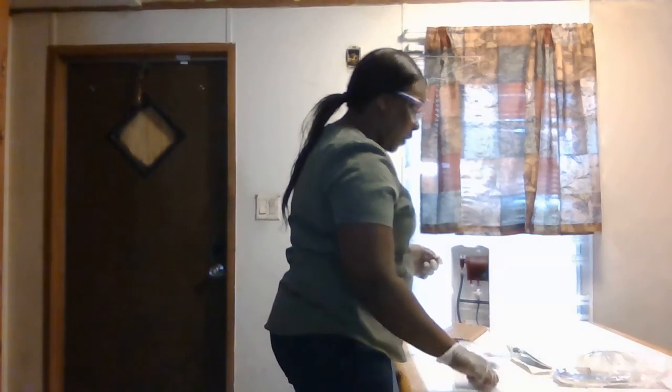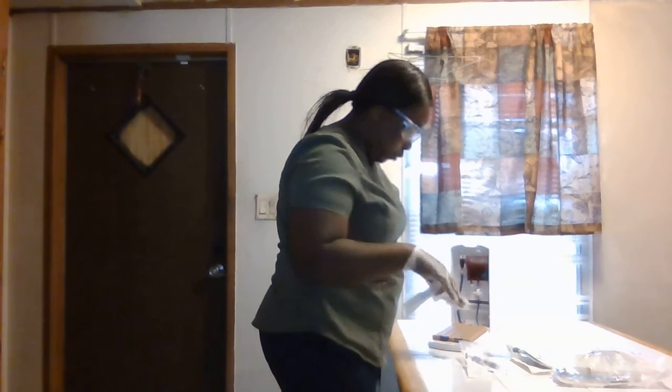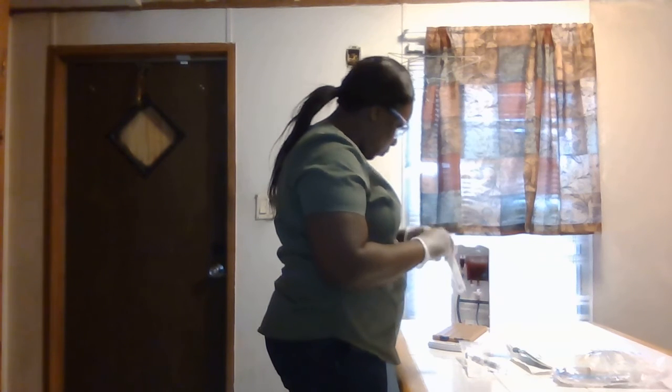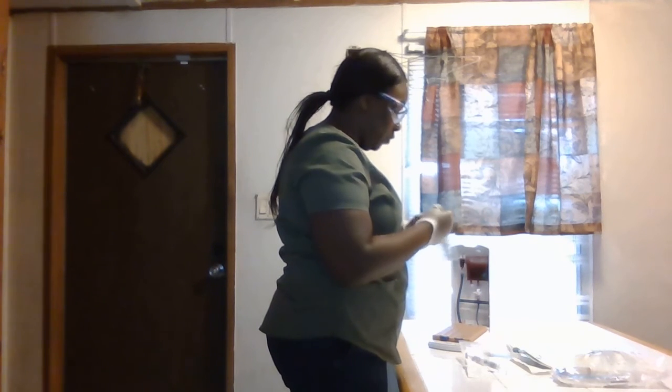All right. So now at this time, I can go ahead and open my Gelco. And again, all of my products that I have here, I already checked for expiration dates and the integrity of the package. Same here, I have my Gelco here, 22 gauge times 1 inch. This is not expired and is ready to go. And again, we can go ahead and open this while we're waiting for the ChloraPrep to dry.